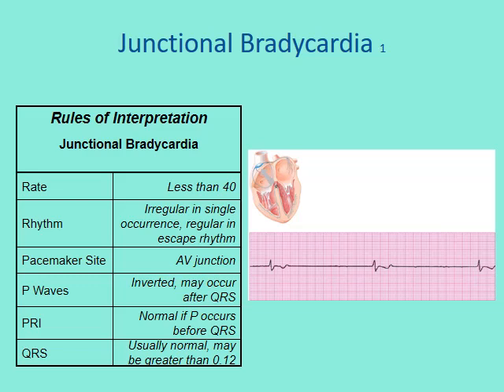the ventricles, depending on the signal. If it's coming from the junction, it'll be narrow. If it's coming from the ventricles, it'll be wide.